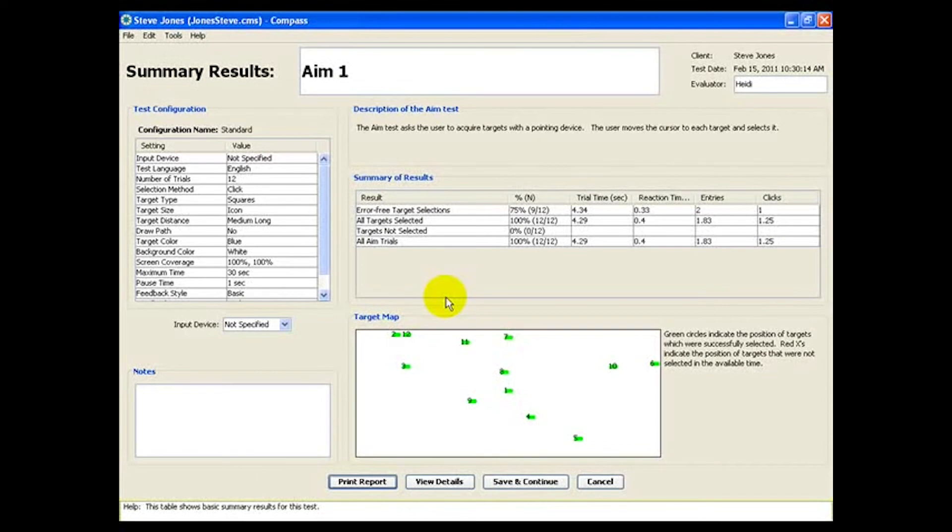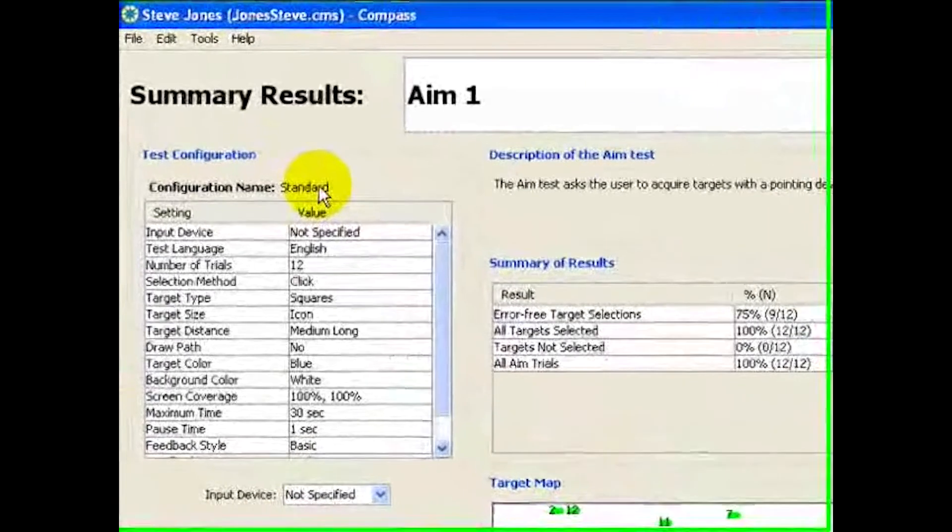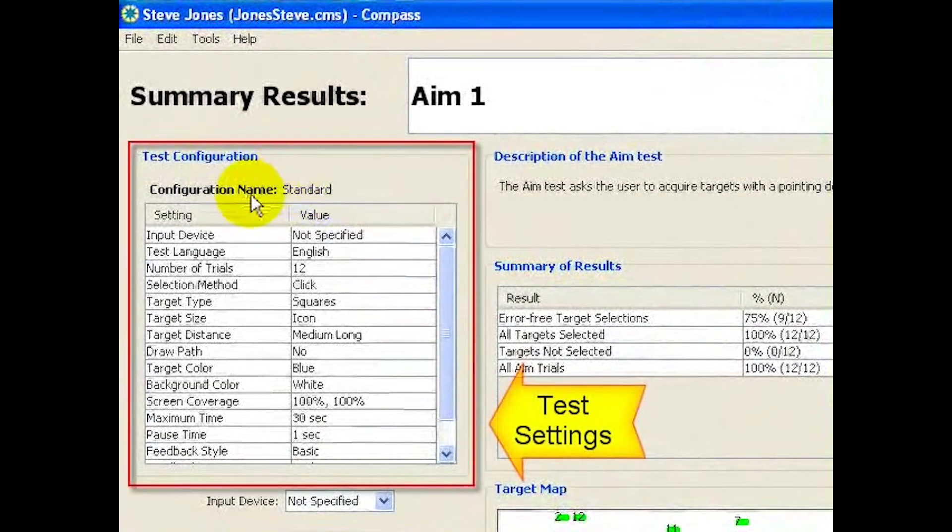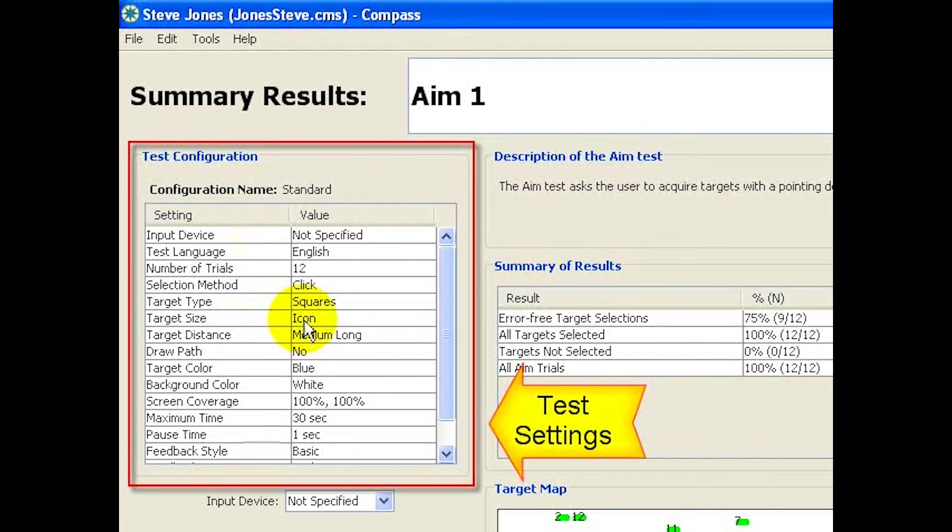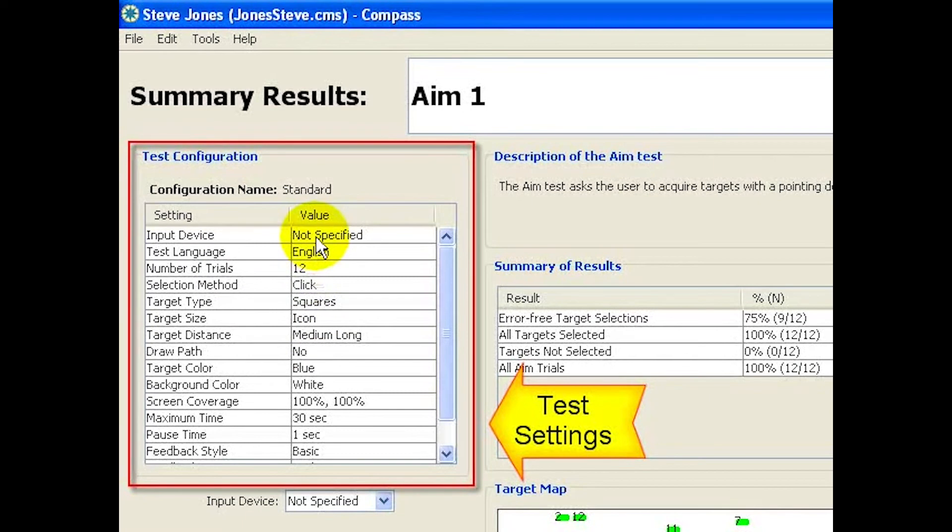And this layout is basically the same for all Compass tests. Over here, we see the settings for the test, such as the target size and distance, the number of trials, and the input device used.